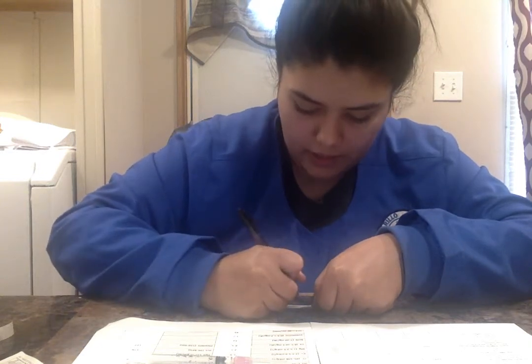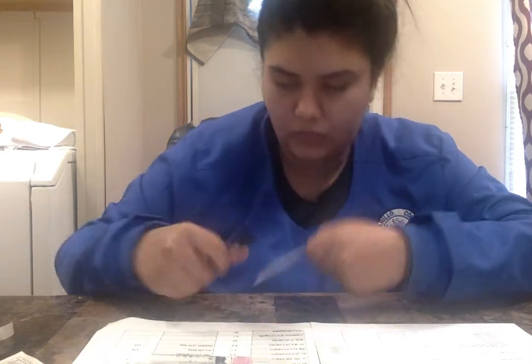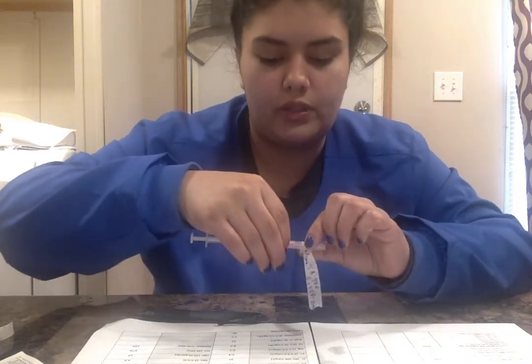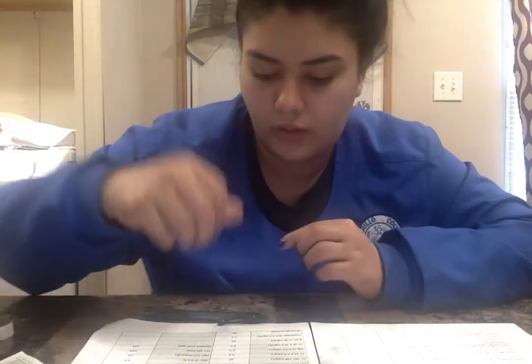And this is going to Kit Llano. Okay, and then we're going to label that. And we're going to put this in our medication cart. And we're also going to put the PPD skin test vial in the medication cart so we can do our third check here in a little bit.